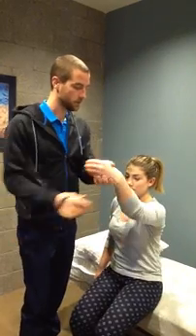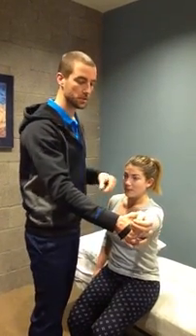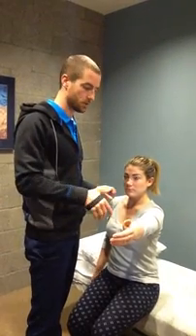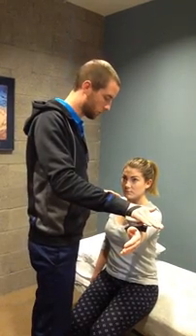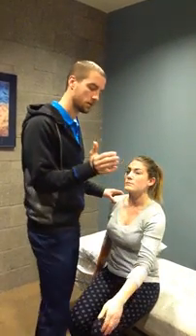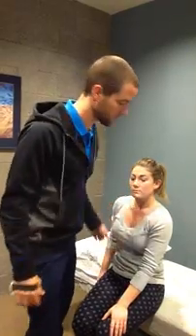The next one we're going to do is supraspinatus, which she's going to be going at roughly scaption, 90 degrees, thumbs up. I'm going to put the dynamometer again on her wrist. I'm coming down. The key is not to bounce on it to get a nice smooth force. Let her get a chance to realize what you're doing and then gradually build up the pressure. Hold, don't let me move you. Hold, hold, hold, hold. Good. There she gets 16.